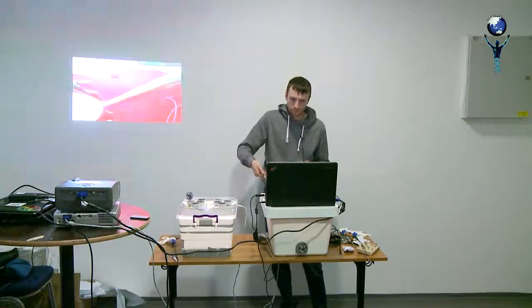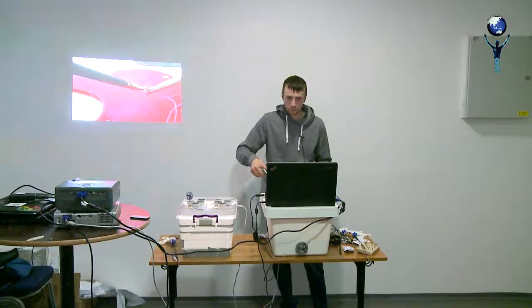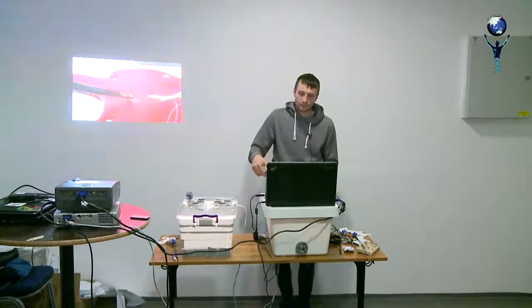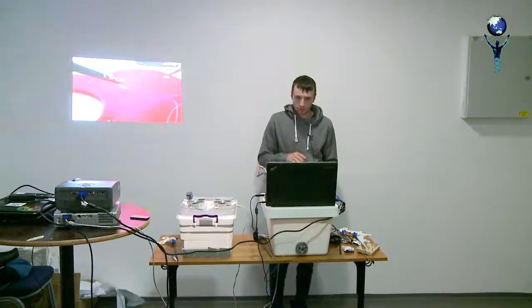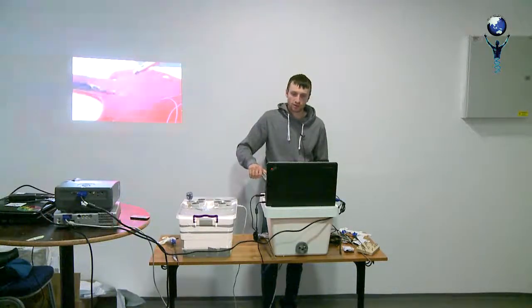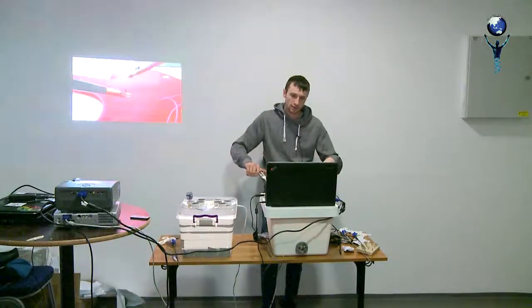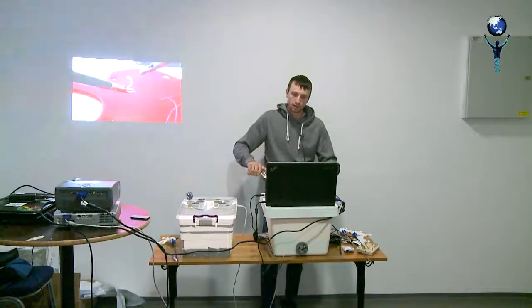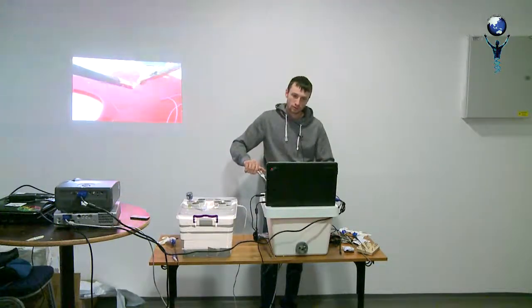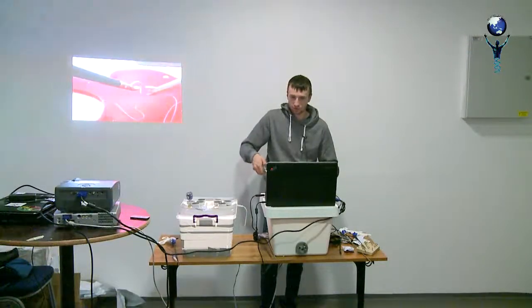You grab the needle with the left hand with the instrument, and with the right hand you can make this exercise, called a dancing needle. So you need to rotate the needle 360 degrees. It's just for training. If you can do this, it's not an appropriate position, you know.